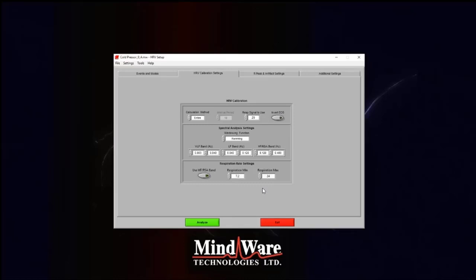And then there's an additional extension onto that: would this justify not statistically controlling for respiration in analyses? This really relies on the reviewer of the journal that you're trying to write to, but in most cases that won't hold up. You can certainly use the RMSSD statistic more commonly without respiration. So if you collected ECG, you didn't have respiration data, and you want to express high frequency heart rate variability, RMSSD is likely our recommendation. With RSA, it's a lot more difficult to get that published, if you will, without the respiration data.